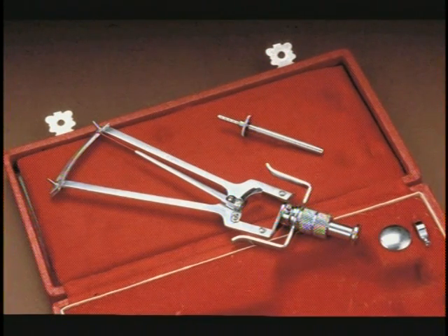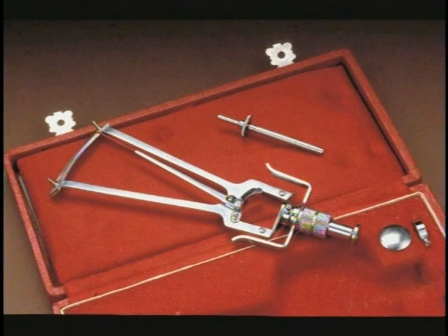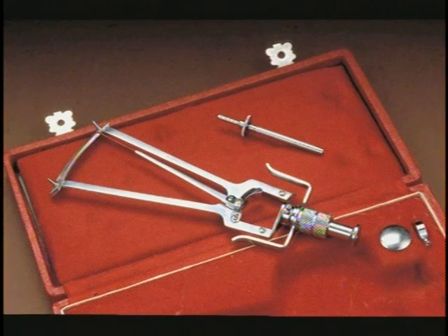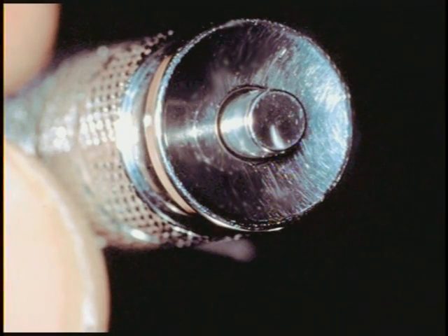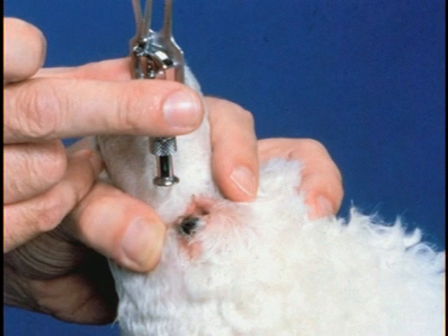The Schiotz tonometer requires assembly, disassembly, and cleaning in order to ensure its accuracy. The footplate is large and the patient must be cooperative in order to place the footplate on the cornea in a vertical position. If the animal is fractious or the eye is painful, then it is unlikely that accurate placement will be obtained and erroneous values will result.